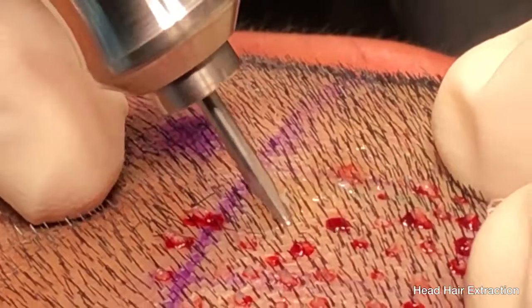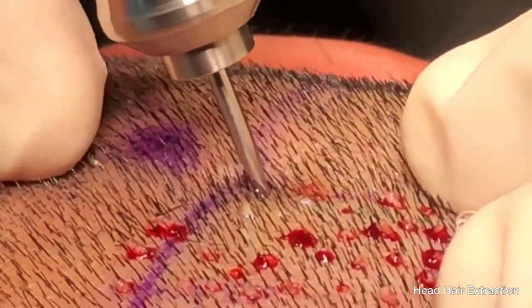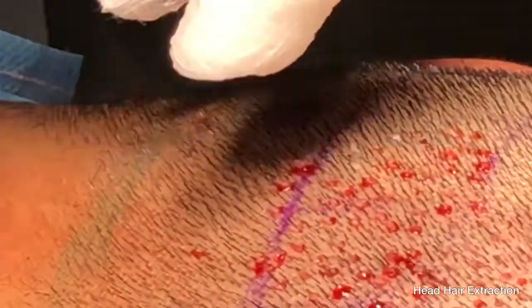Most of the grafts are already free when the swipe maneuver is performed after the Dr. U Graft intelligent punch scoring. In this case, at least half of the grafts obtained are already out.